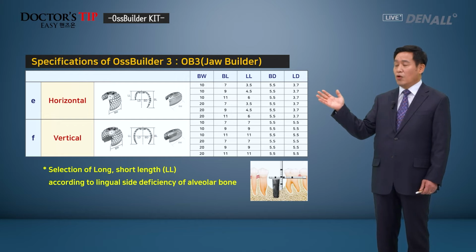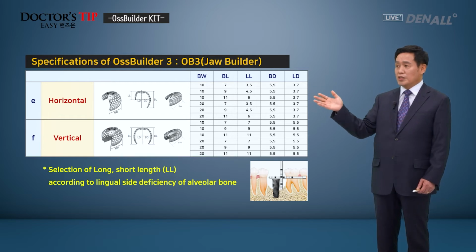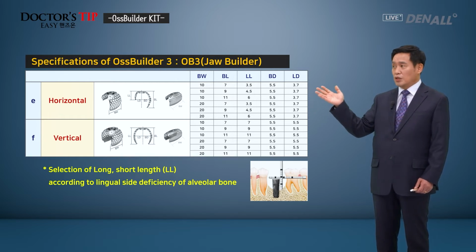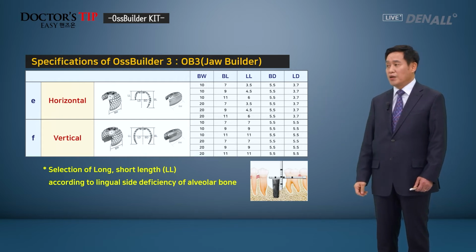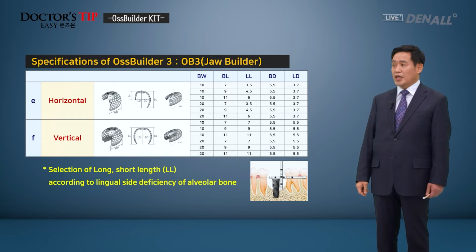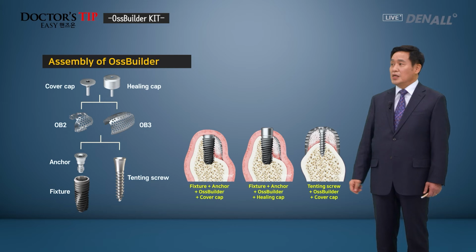When you don't use a fixture in 2-stage surgery, you can use a tenting screw, horizontal, vertical, on both sides, and lingual. You'll be able to use it in multiple ways because there are different heights and widths. You can choose depending on the defect size.